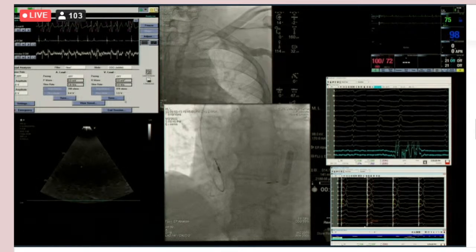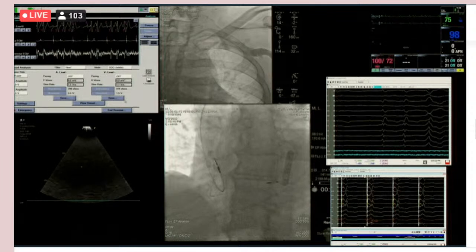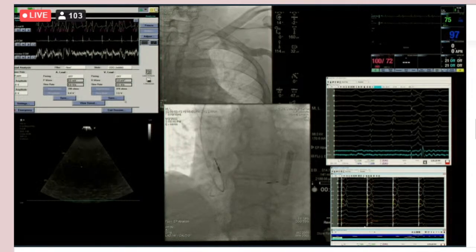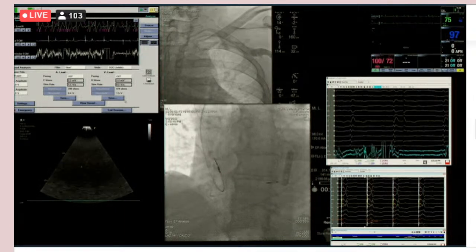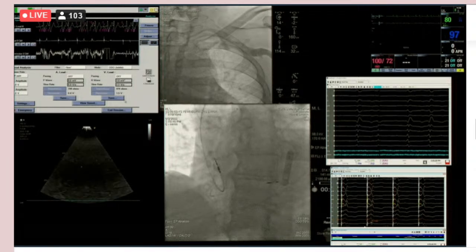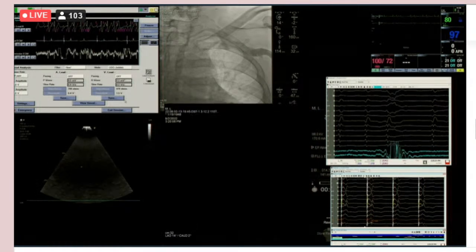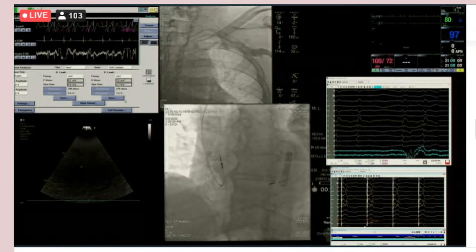And I think the comment you made is so key. No more should we be putting leads in the RV apex. Long gone are those days. Every time, aim for the septum, and apical leads, especially in elderly or even anyone, unless they have super thick RV hypertrophy. But yeah, I haven't put a lead in the RV apex for ages. I always put them in the septum, except in the one condition of a hypertrophic heart with an outflow tract obstruction. For those, I want to pace apically. That's the only patient now where I'll put the lead in the apex.